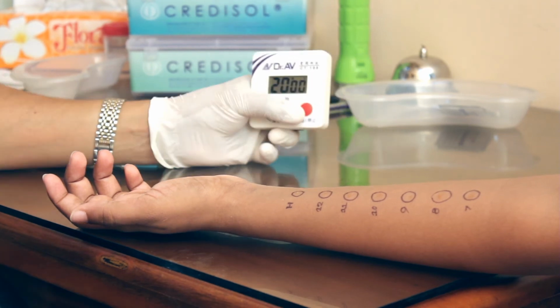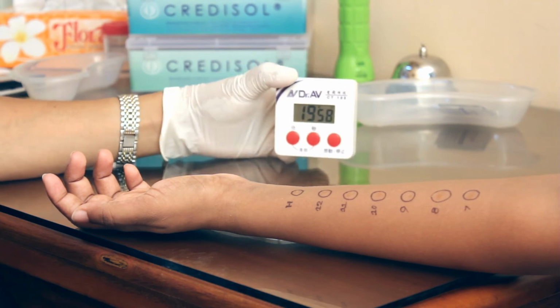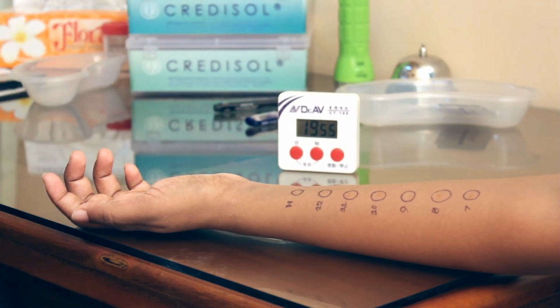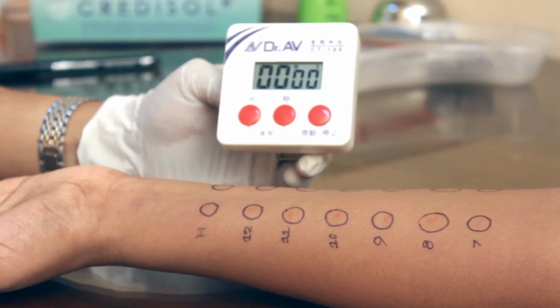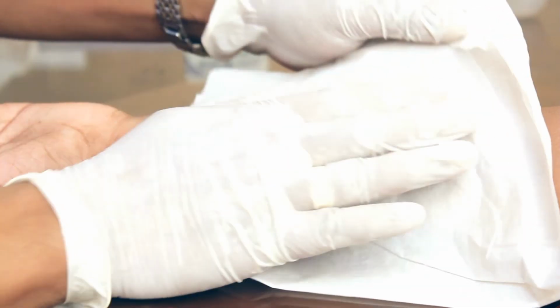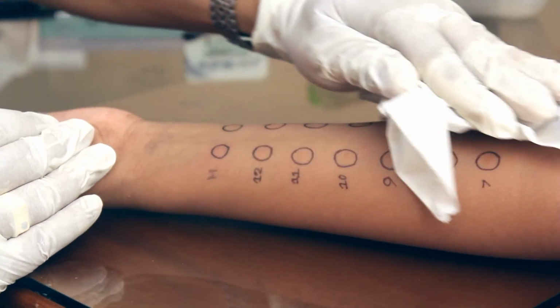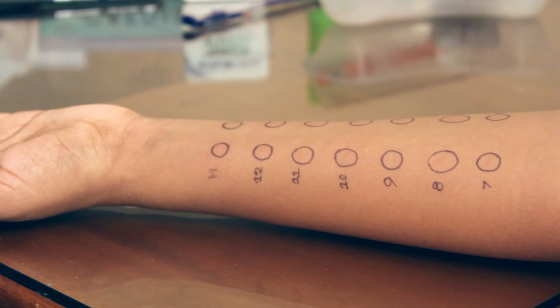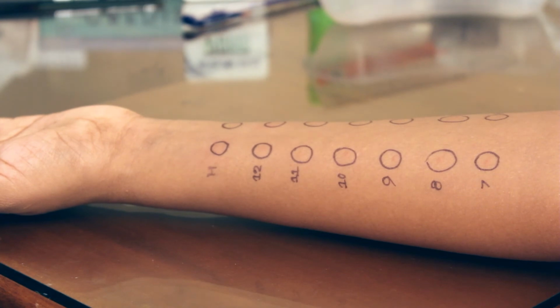This test has to be read after 20 minutes. Therefore, I am using a stopwatch to calculate 20 minutes. Once the 20 minutes are over, we start reading the results of the test. First of all, we have to dry the skin, and then the next thing we do is read the test results.